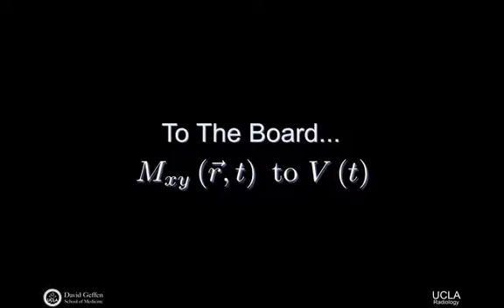It's free precessing, so we know it decays according to e to the minus t over T2 star. So remember that echo forms over a finite period of time. It has some state of magnetization initially, but that state, of course, is free precessing and will have some decay associated. If we write this as a laboratory frame term, then we also need to include precession, which we haven't really written this way before, but we can. So just to remind you, underneath here, this is just T2 decay. And this term here is precession. So we can recognize that as a laboratory frame term.